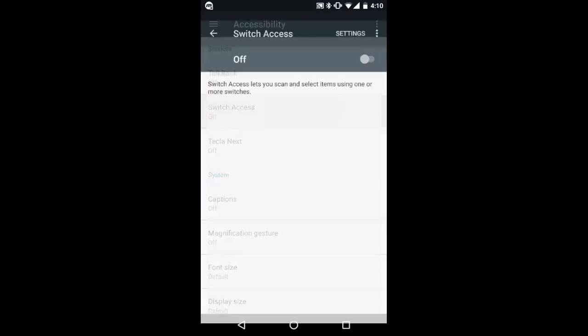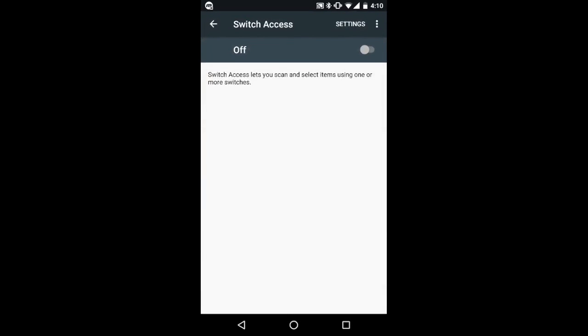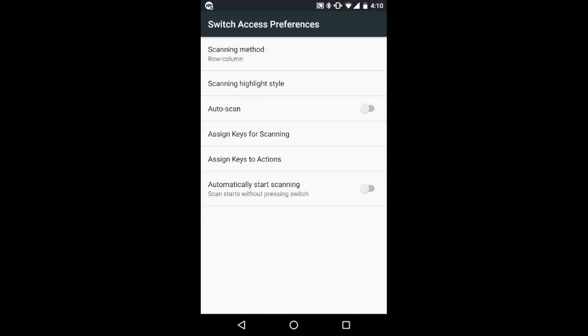Then select switch access. On the switch access screen, click on the top right corner to go to switch access preferences.